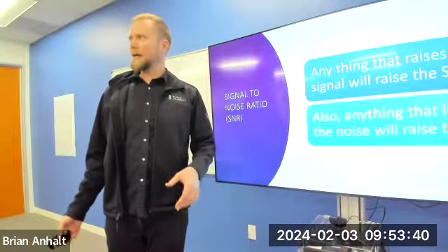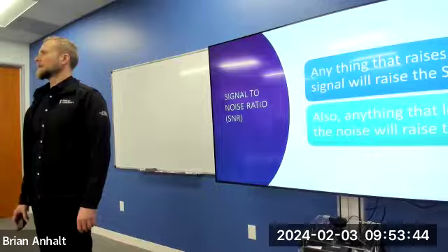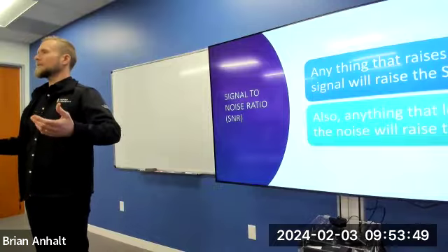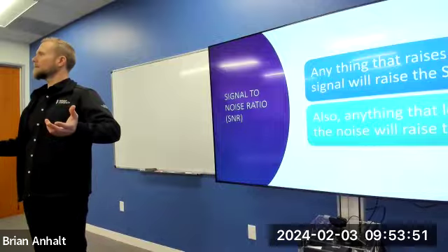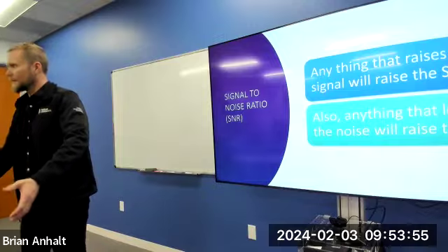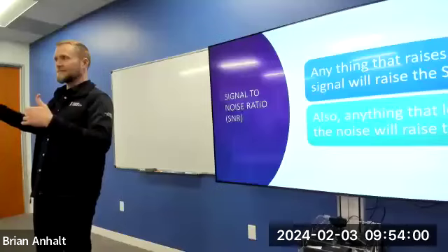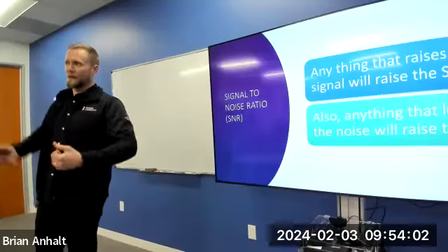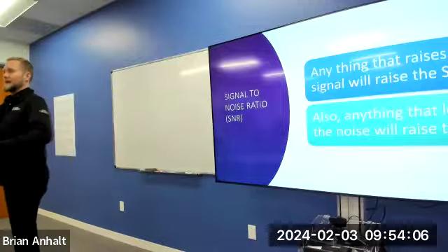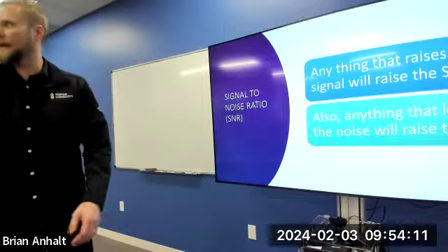So you can think about it mathematically, or you can think about it like this. If all of you were talking, I'm going to have to speak louder for you to hear me, right? But I can speak quiet like this because none of you are talking. You can hear me well because the noise is low, right? So if the noise is high, the signal to noise will be low. But if the noise is low, the signal to noise will be higher. Also, if the signal's high, obviously the SNR is going to be high. If the signal's lower, the SNR will be lower, right?